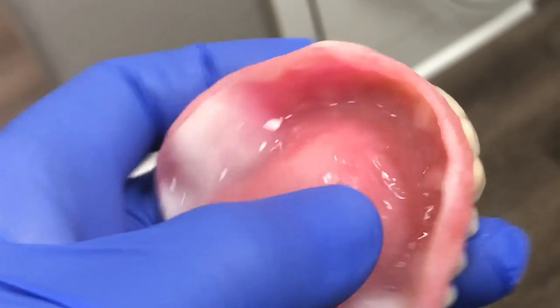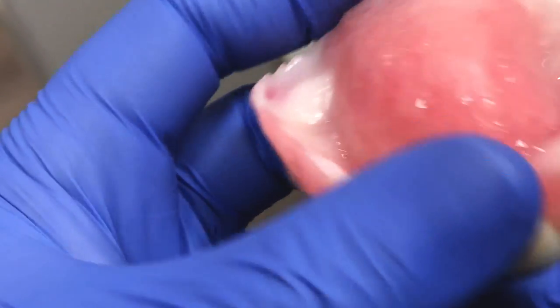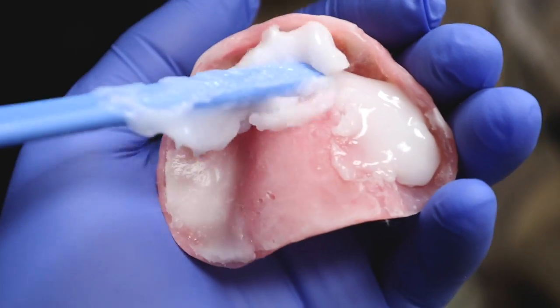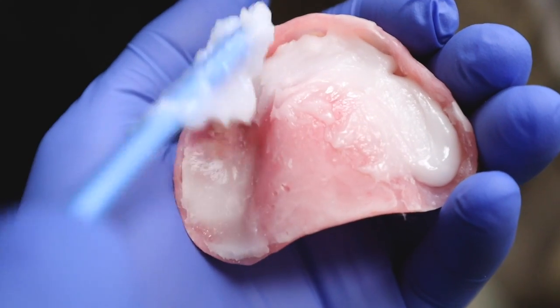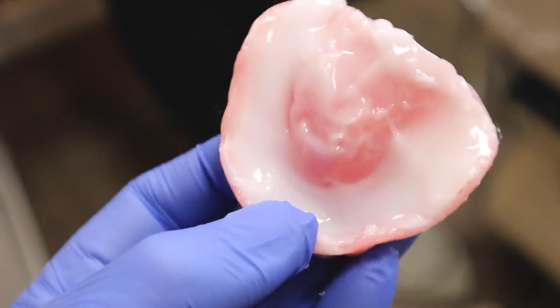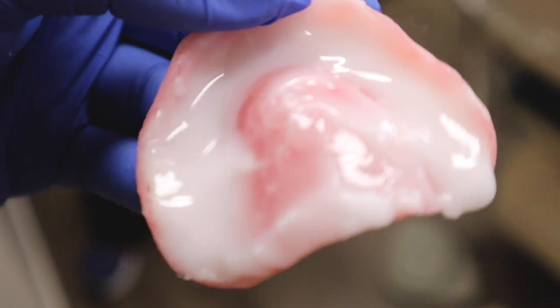Here's a video of me checking out some Lynol that has washed out of the denture, so I'm going to put a fresh layer in. Lynol is pretty easy to mix and put into the denture. It starts off a little thicker but gets quite runny, so I make sure not to put too much around the palate to avoid it going down the patient's throat. I'm placing a minimal amount of material on the palatal part of the denture.